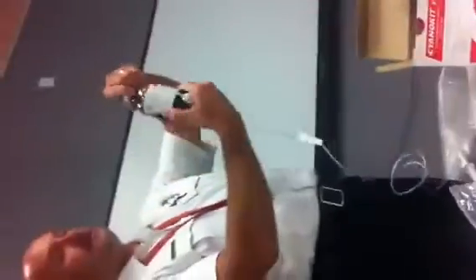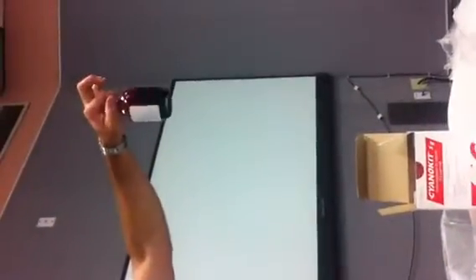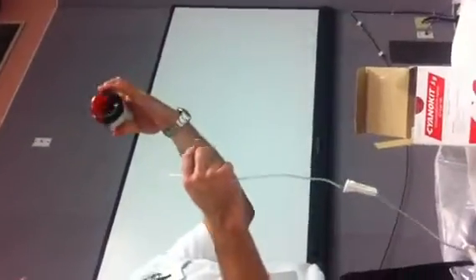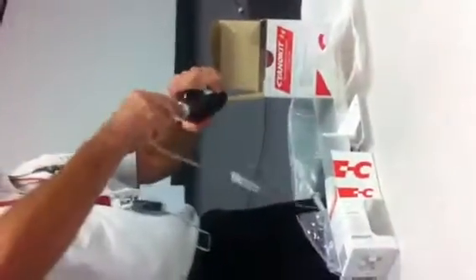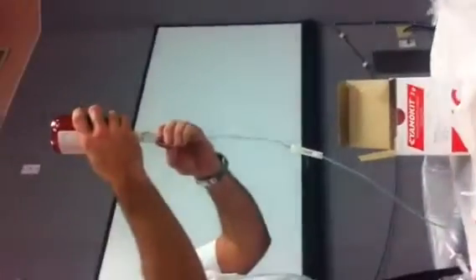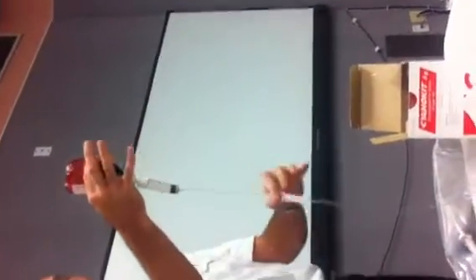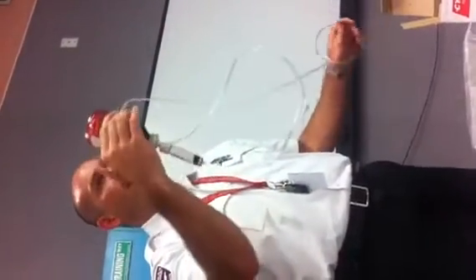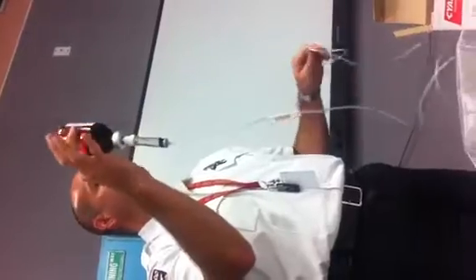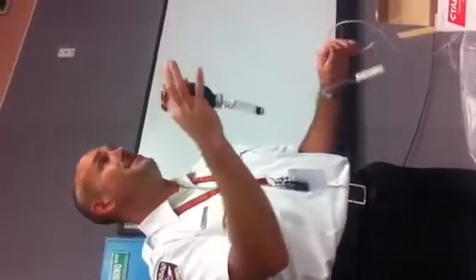So you can see — looks pretty good. We'll just swirl it around. They're going to spike it. So they're going to infuse this over 15 minutes. They're not really calculating a drip rate — we're not using micro versus macro. We just need to let them know that this gets infused over 15 minutes. That may be different in the hospital.